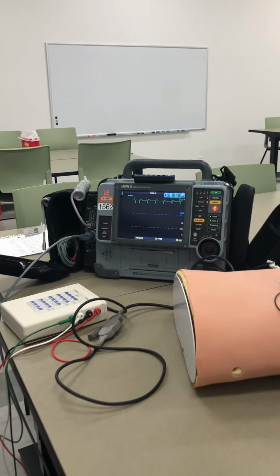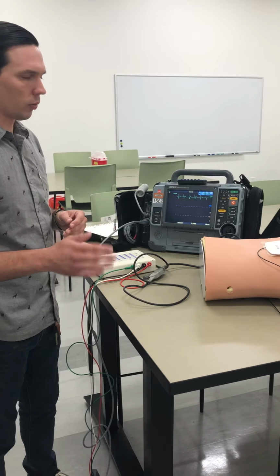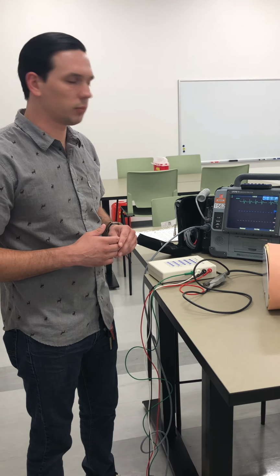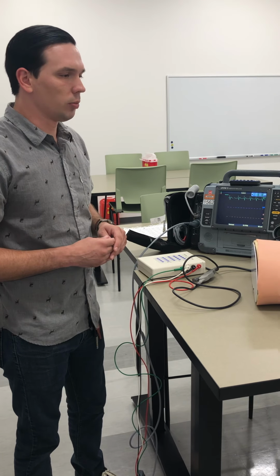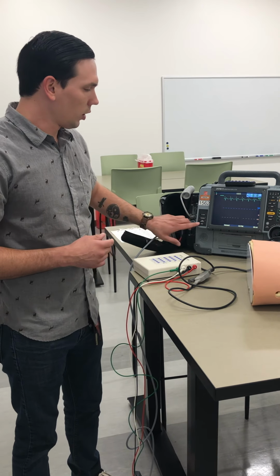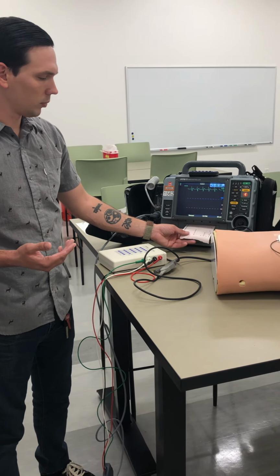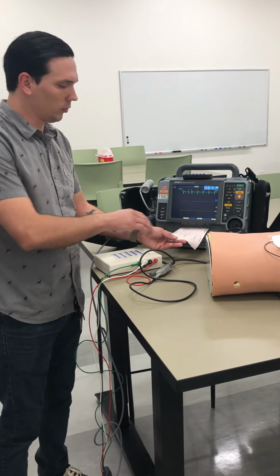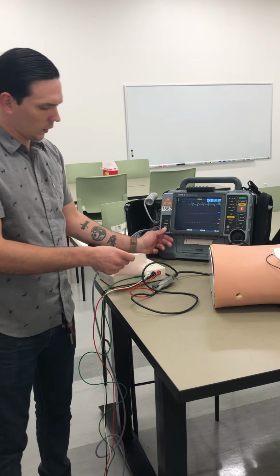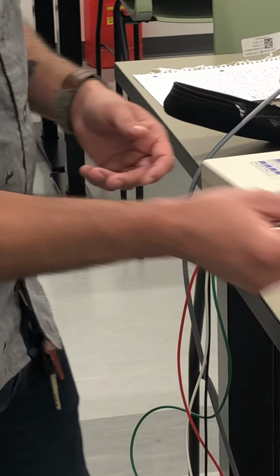observe on the monitor and check for a corresponding pulse, which means putting your finger on the carotid, femoral, or radial pulse. This is making sure that you have mechanical capture along with electrical capture. Also note any changes in your patient's status, from blood pressure to mental status and any other changes. Another thing that you want to do is print out at least a 6-second strip. The reason why you want to do this is because you can visualize the pacer spikes on the strip, along with noted pacemaker arrows at the bottom of the strip.